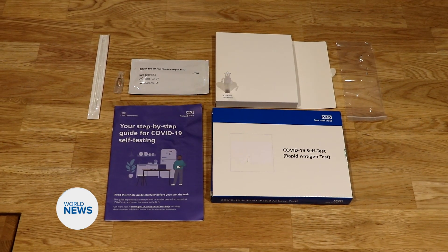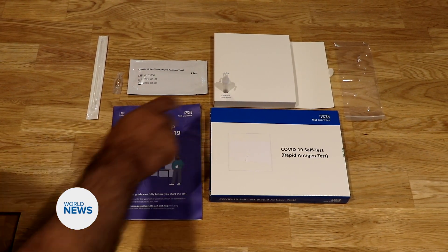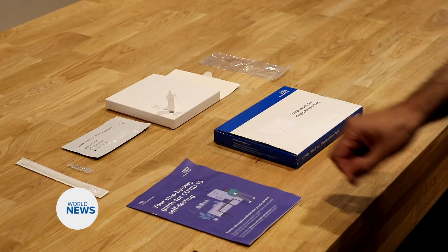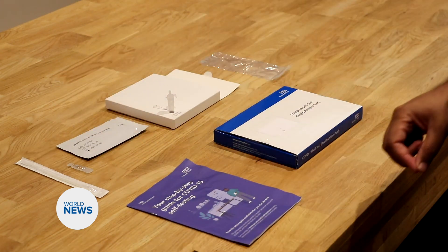Here you can see the test kit. The test kit contains a swab, an extraction tube holder, an extraction tube itself, the buffer solution, the test strip in a foil, and also a waste supply bag.